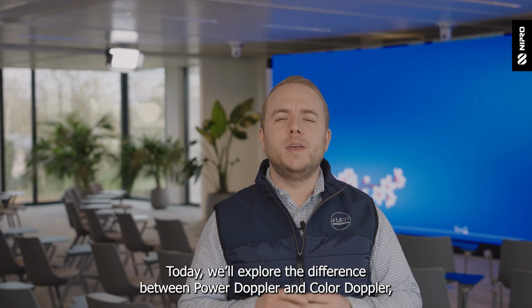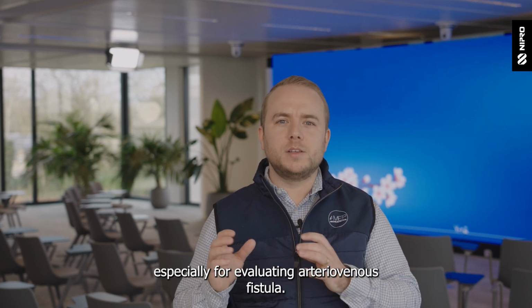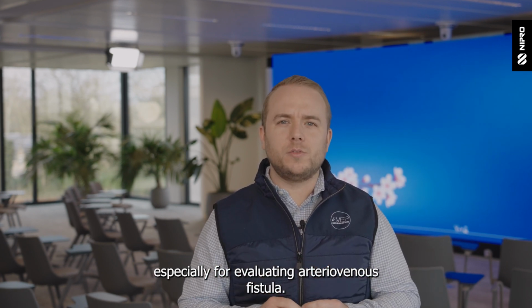Hi everyone! Today we will explore the difference between power Doppler and color Doppler, especially for evaluating arteriovenous fistula.